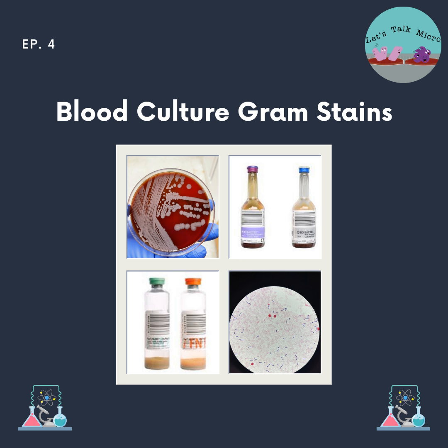And a lot of times, that change in pH is detected and you can barely see any organisms. But then you do a cytospin slide and then you're able to. Whereas with the other systems, when you're loading the bottles, you're opening those drawers all day and they take longer to incubate. So most times when you didn't see anything, it was actually a true NOS, because there are other factors that can cause the bottles to flag as positive. For example, excess white blood cells, WBCs, can cause the bottles to falsely flag as positive.